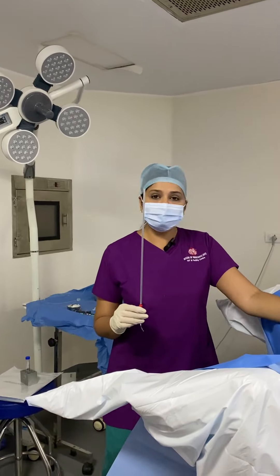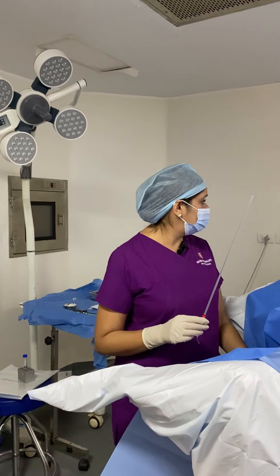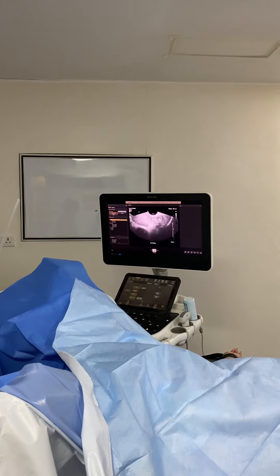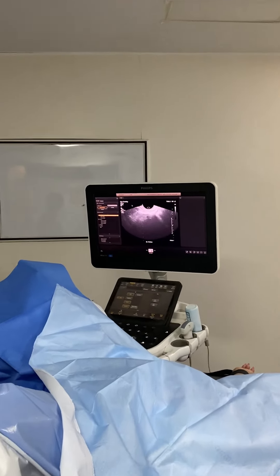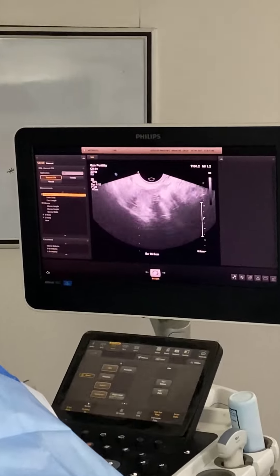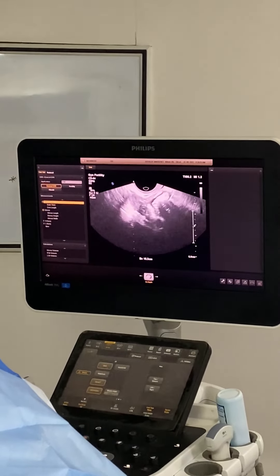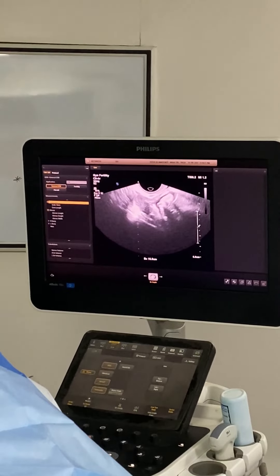Now we're going to see with a TVS ultrasound the ovarian reserve. We can see one ovary where we see almost no follicles.